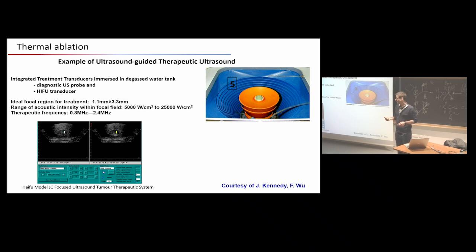thermal ablation. Why? Because they are doing that in soft tissue, and ultrasound imaging is quite good for imaging soft tissue. It's cheaper, it's real time, so there are some advantages of using ultrasound. That's typically what you can see in this image. So they applied ultrasound at the focal here, and you can have a look here. You can clearly see enhancement of the contrast in the ultrasound imaging, and that corresponds to a burning of the tissue.